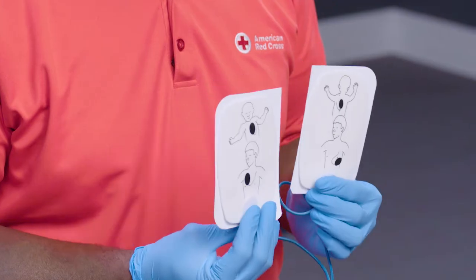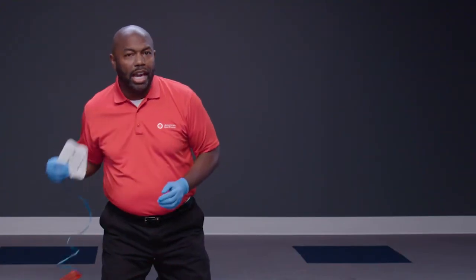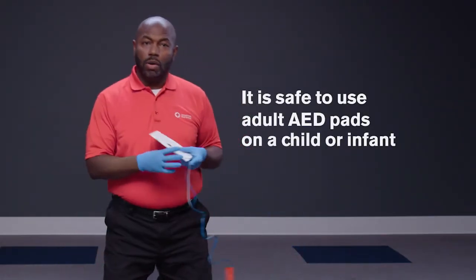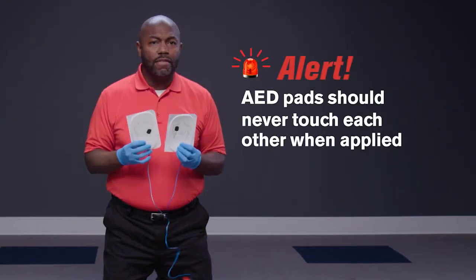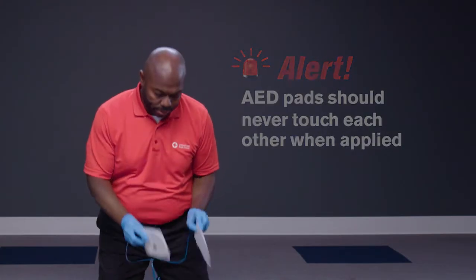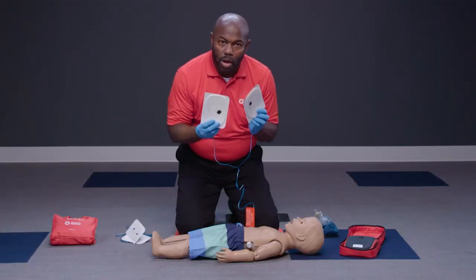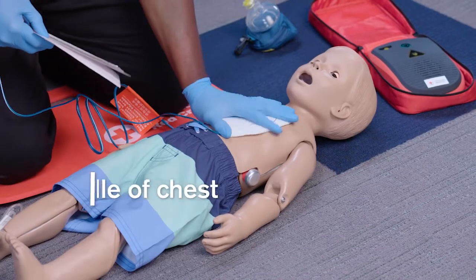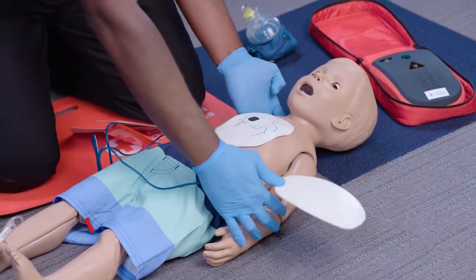For children, position the pads as depicted in the diagram. If pediatric AED pads are not available, it is safe to use adult AED pads. However, the AED pads should never touch each other. So if it appears the pads would touch, place one pad in the middle of the chest and the other pad on the back between the shoulder blades.